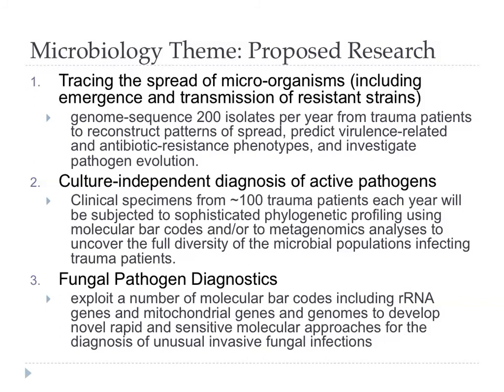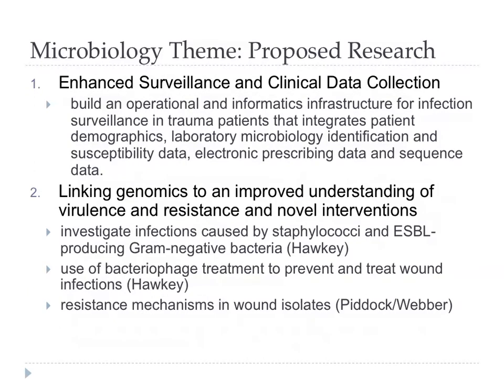So we are aiming to exploit a number of different molecular barcodes, ribosomal RNA genes, mitochondrial genes, genomes and so forth, to try and develop novel, rapid, sensitive molecular approaches for this, particularly focusing on unusual filamentous fungi, which are a problem here. The numbering's gone wrong, but this should say 4 and 5.